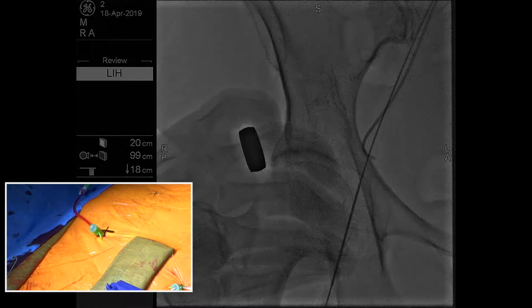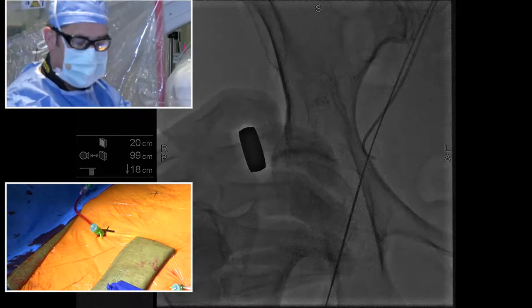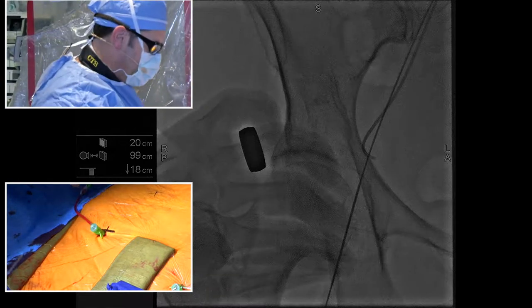And the reason they're going to be deployed now is because we're going to stretch the hole that we just made in the artery to a much larger size. And if we try to deploy those later, the needles that come through the device are not wide enough to grab enough tissue. And so we want to put those in now. It's what we call pre-close. So we're going to pre-close this.